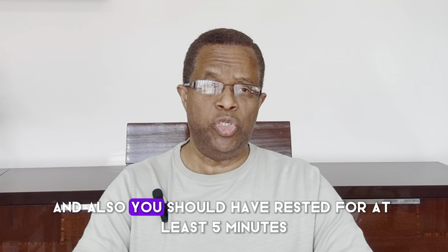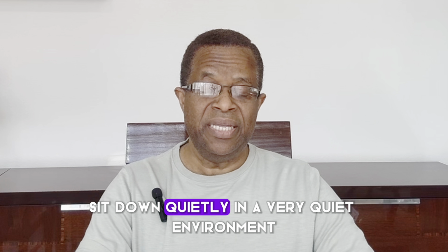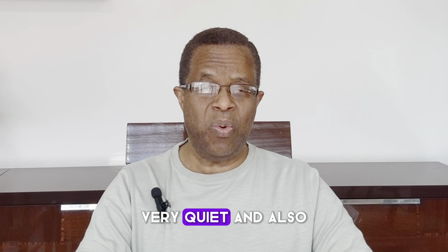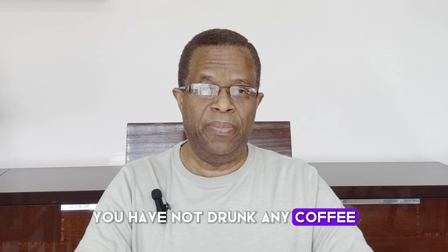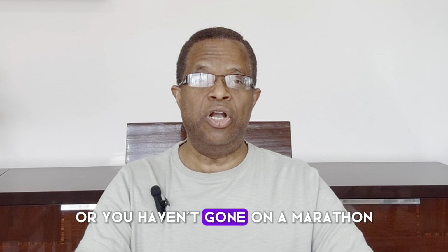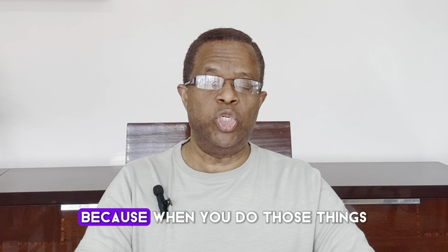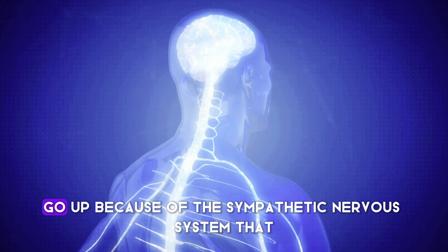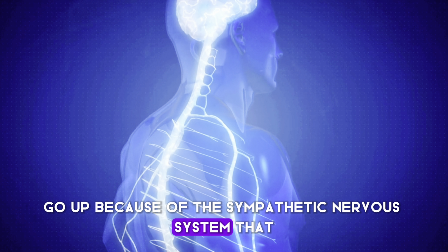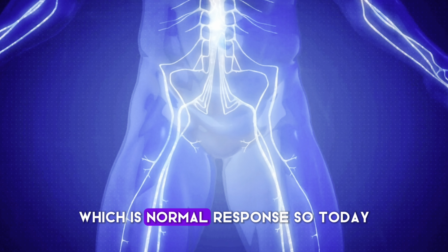And also, you should have rested for at least 5 minutes, sitting down quietly in a very quiet environment. And also, you have not drunk any coffee, or gone on a marathon or done some vigorous exercise. Because when you do those things, naturally your blood pressure is going to go up because of the sympathetic nervous system, which will increase your blood pressure and your heart rate, which is a normal response.